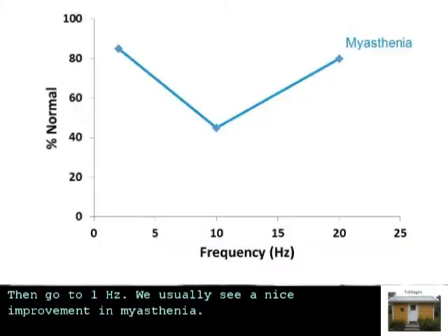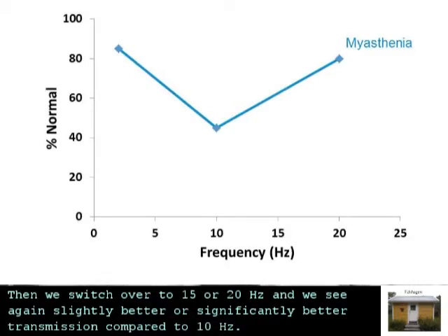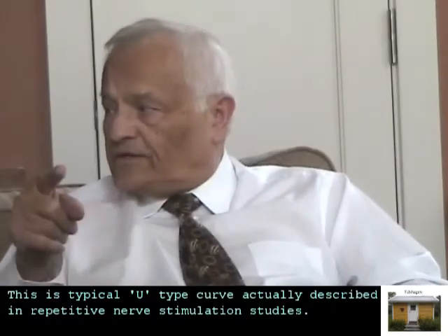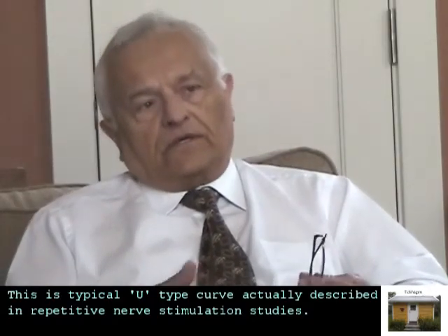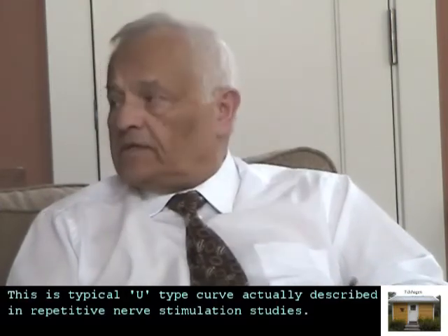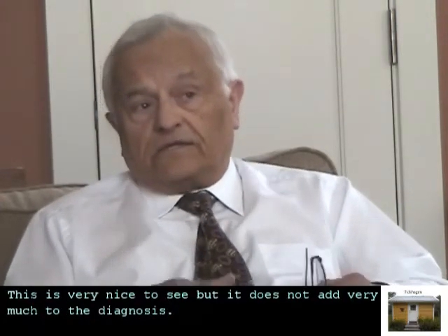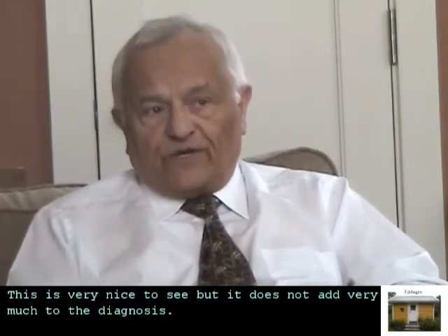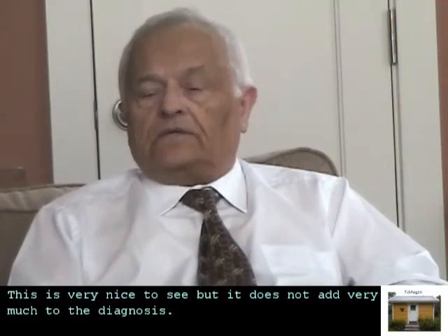We usually see a nice improvement in myasthenia, and then we switch over to 15 or 20 Hertz, and we see again slightly better or significantly better transmission compared to 10 Hertz. So this is a typical U-type curve, actually, described in repetitive nerve stimulation studies. And this is very nice to see, but it does not add very much to the diagnosis.